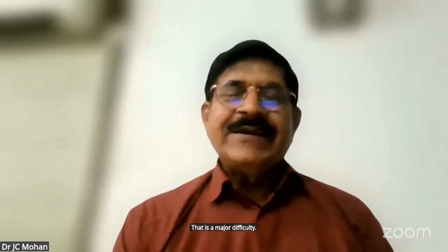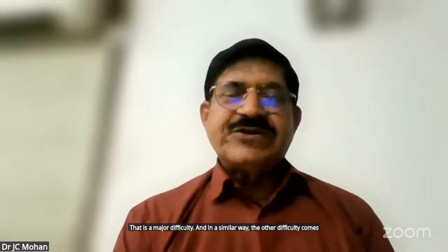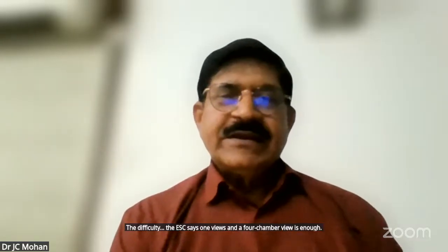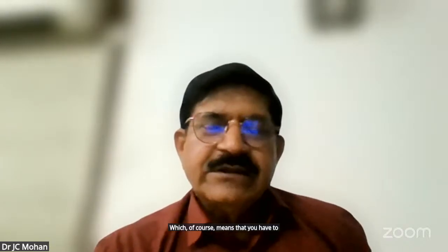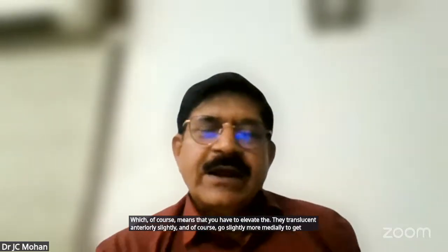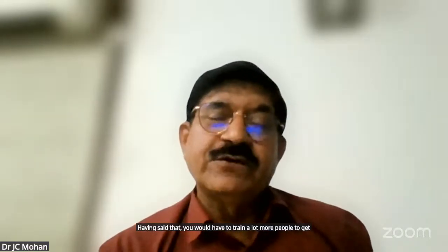In a similar way, the other difficulty comes with left atrial reservoir strain. The ESC says one view, the four chamber view, is enough. The Americans say two views and average the two. And they again say that you have to have a focus view, which of course means that you have to elevate the transducer anteriorly slightly and go slightly more medially to get the left atrial volume. Having said that, you would have to train a lot more people to get a focus view.